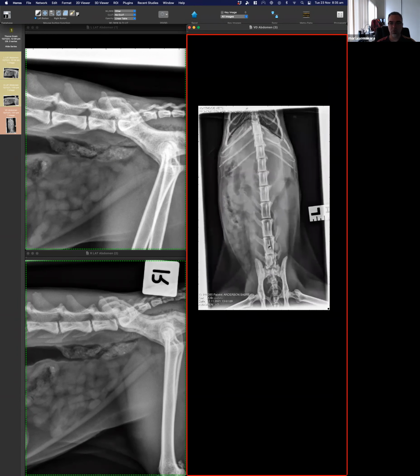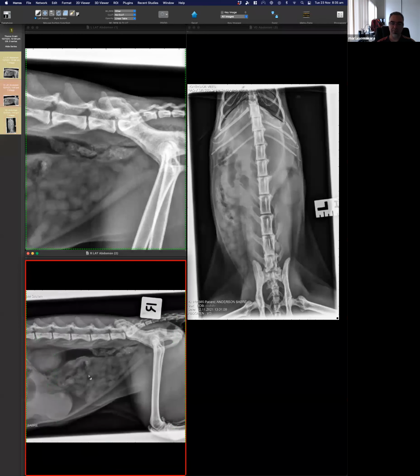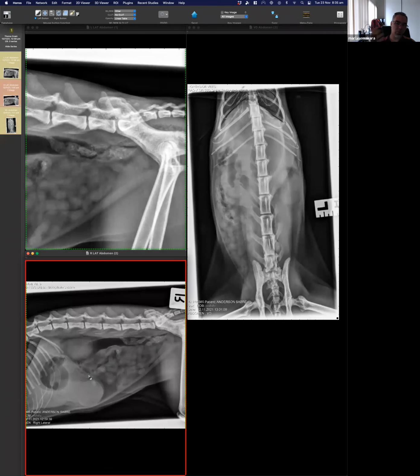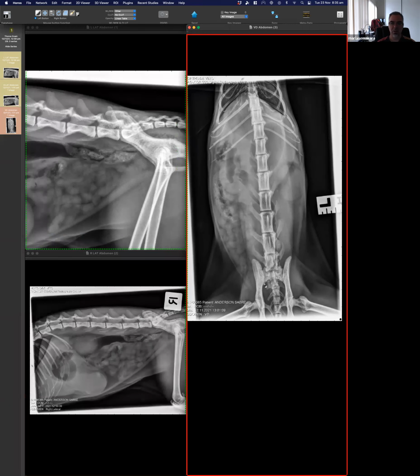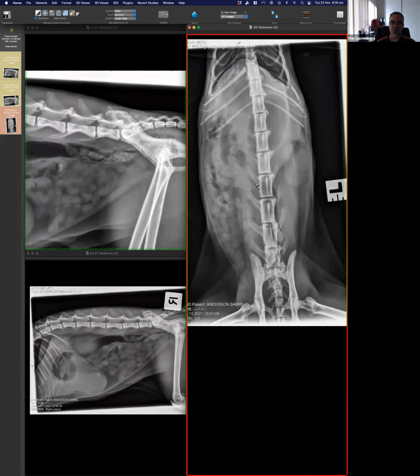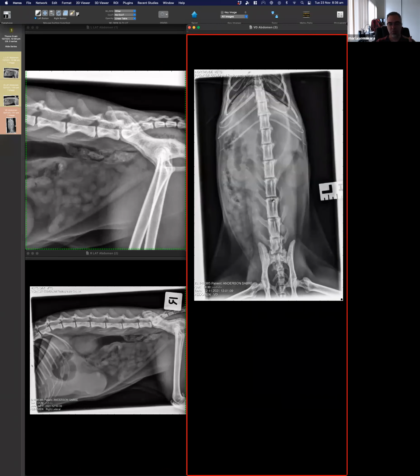I see your point, and I recognize that that's a difficult structure. And then sometimes we dismiss things because they don't fit in our explanation. And sometimes we go back and we realize that we were wrong. I think in this particular case, because I don't see any other abnormality in the lateral projections and there is feces and gas in the colon, I think that's the case. And then the other point that I want to make is that your call, which is completely right, is that there is not a single bowel loop in the left side of the abdomen. So why? And probably the only thing that I have to comment are two or three things.